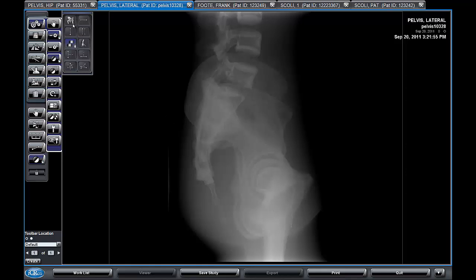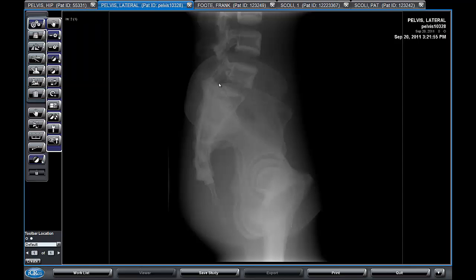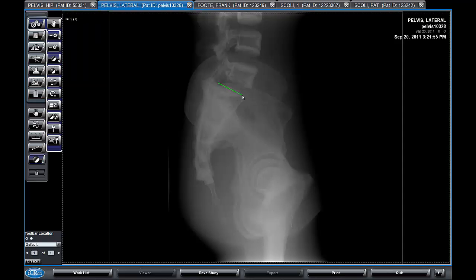We have a tool for measuring the pelvic incidence and a couple of other angles. We use this by dragging a line across the top of the sacrum and then dropping a point at the center of the femur head, and that creates three angles. The one on top is the sacral slope, the one in the middle is the pelvic incidence, and the one on the bottom is the pelvic tilt.